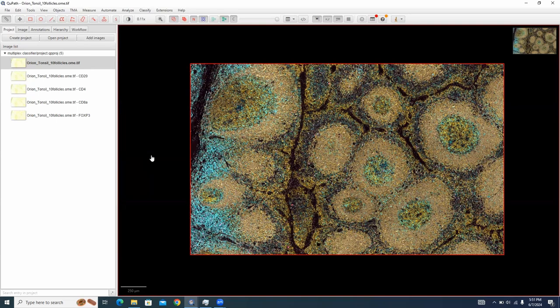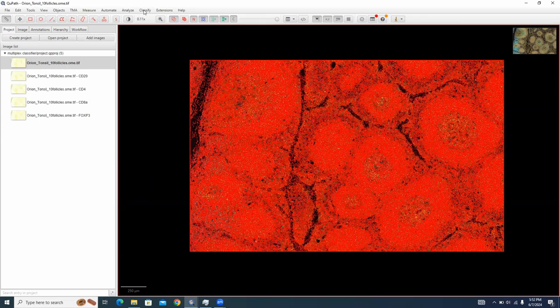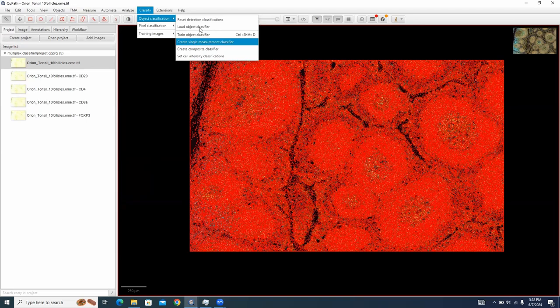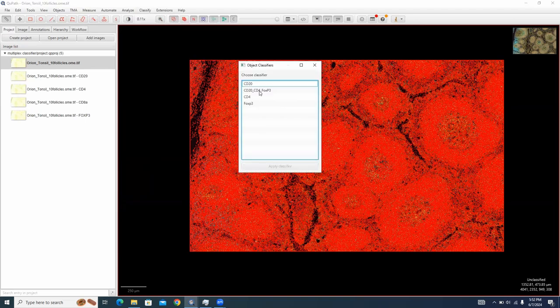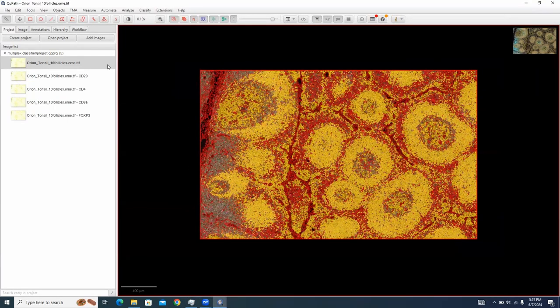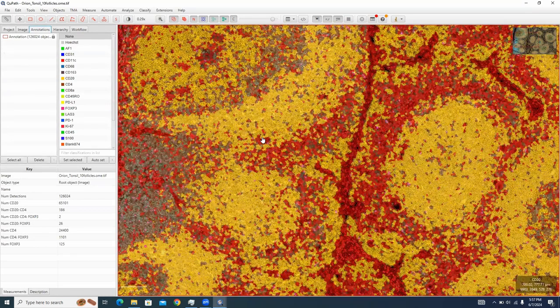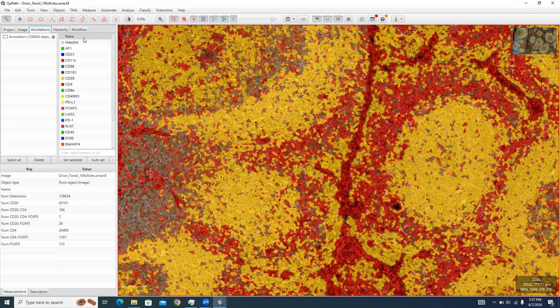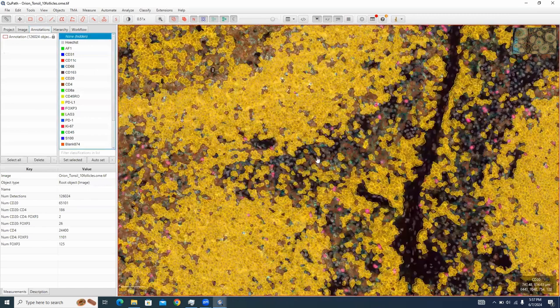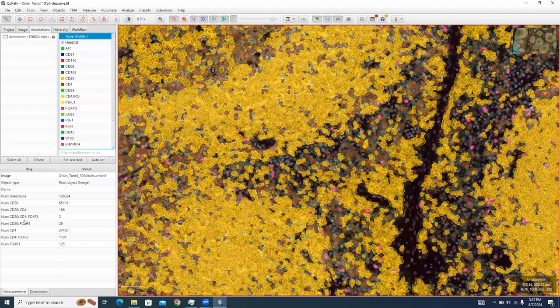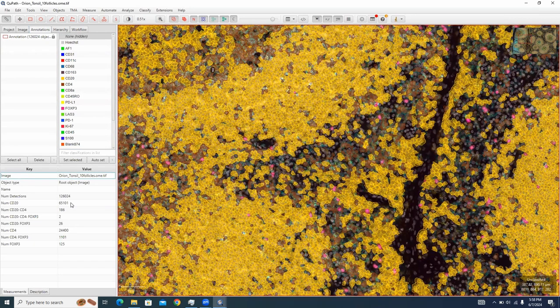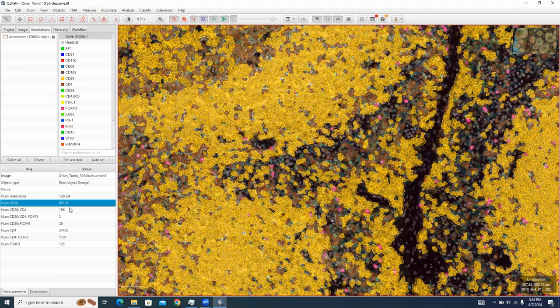But in total, if we run the combined classifier, which I called CD20, CD4, FOXP3, hit apply. This might take a couple seconds. All right, and after a couple of seconds, you can see the results. The yellow is the CD20, the true red is the unclassified, which I'll get rid of. The brown is the CD4s, and the pinks are the FOXP3s, and if you look over here on the left, you can see the numbers of each of the types of cell, and overall, there are 65,000 CD20, of which just over 200 are some combination of impossible cells. So that's CD20, CD4, or CD20, FOXP3.